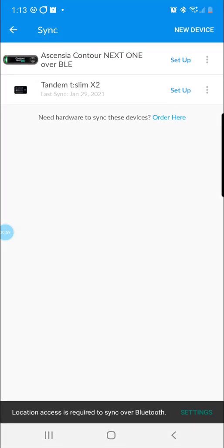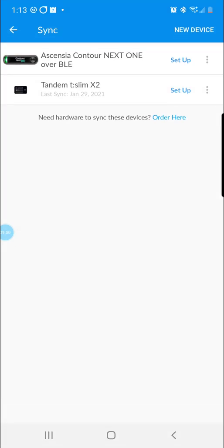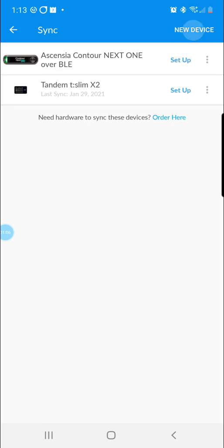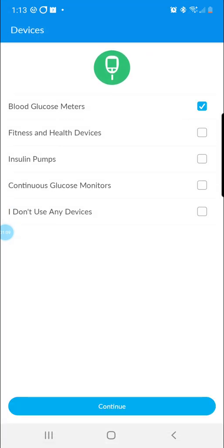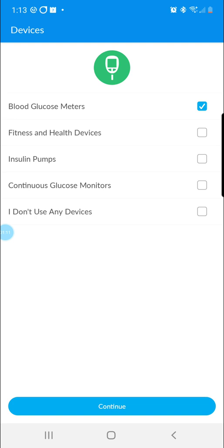If you don't see the OneTouch VarioFlex in your list of devices associated with your account, click new device in the upper right hand corner and then blood glucose meters and continue at the bottom of the screen.